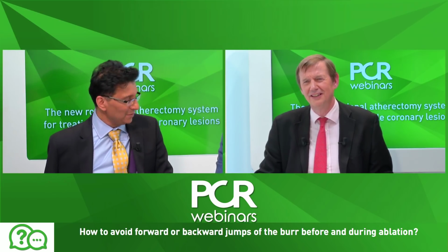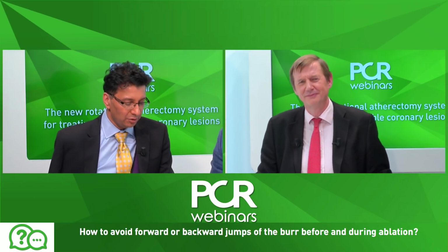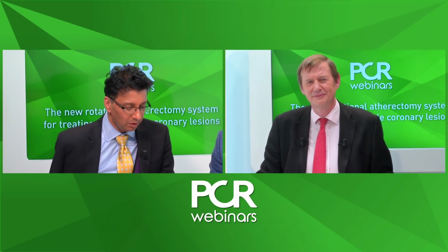Yeah, I've got it in front of me, so I'll demonstrate. When I train, I always advise to lock when you're advancing the burr, to give yourself about 1.5 centimetres of safety distance. Then I always park the burr at least 1 centimetre proximal to the lesion. I open this and test, ready to spring it back, because sometimes there's stored energy in the spring cord, particularly in tortuous vessels coming from the arm or the leg, which leads to it lurching forward as you release the tension on that initial run.